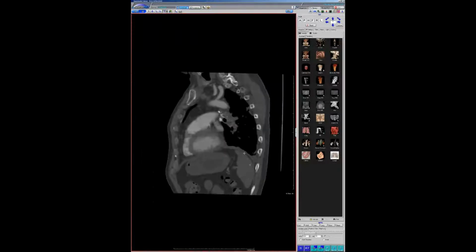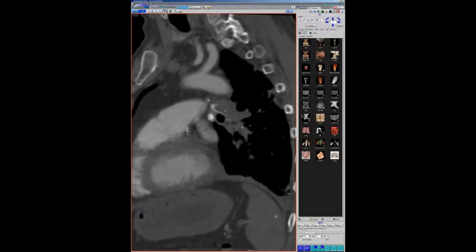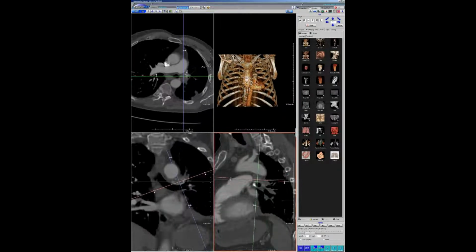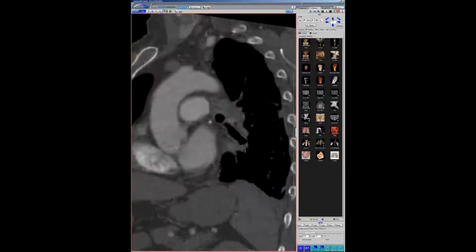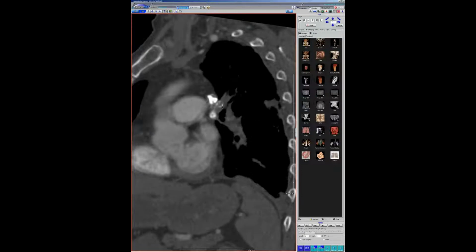it's bizarre looking for clot as it is, but let's go down the meat of it. It's very strange, this kind of laminar calcification along the PA. Let me see if I can find this. So here's the left PA, and you can see where the calcification is, where the vessel should have been. So this wall of calcification, you can even see where the left upper lobe branch should have been.